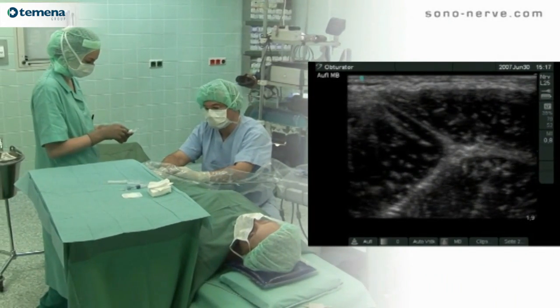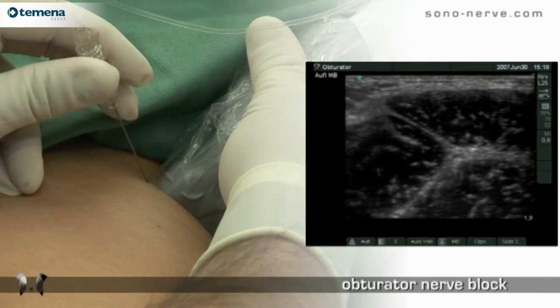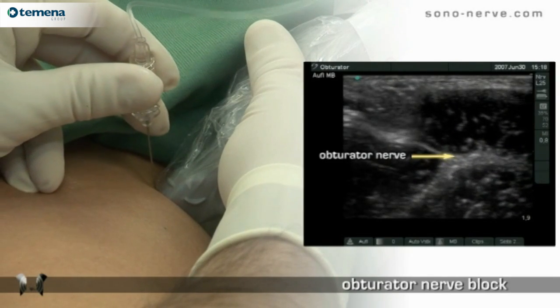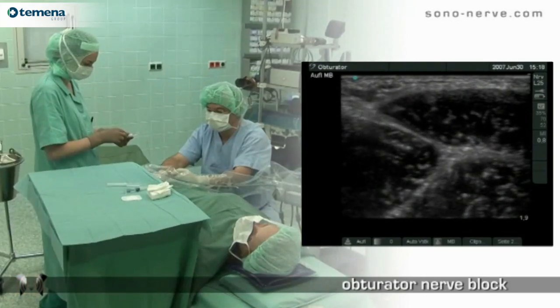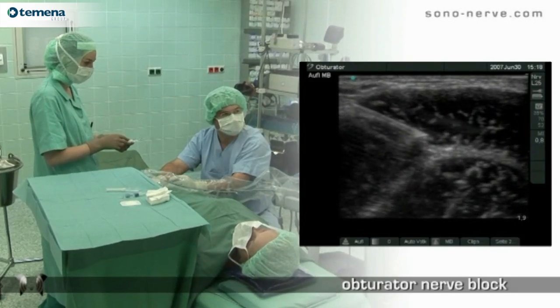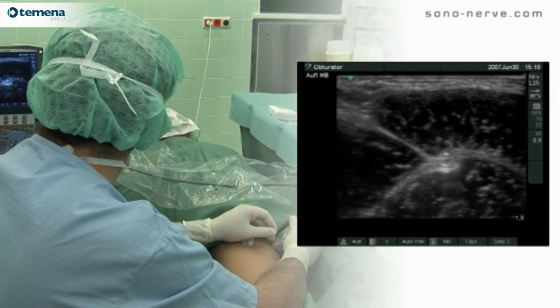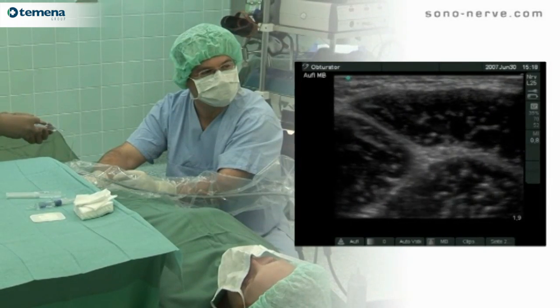This technique uses an in-plane approach. The in-plane technique is very good for showing the entire length of the shaft and the tip of the needle as it approaches the nerve. We try to place the needle in the fascial plane between the pectineus muscle and the adductor longus muscle, as this may reduce bleeding in comparison with the needle passed directly through the muscles.